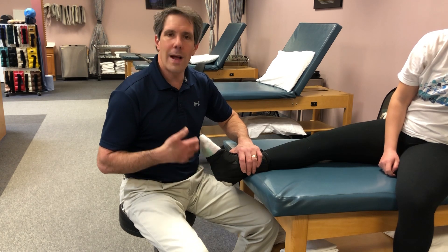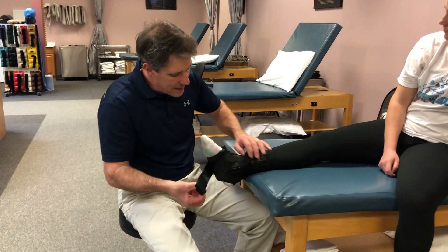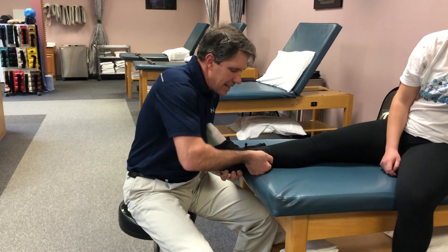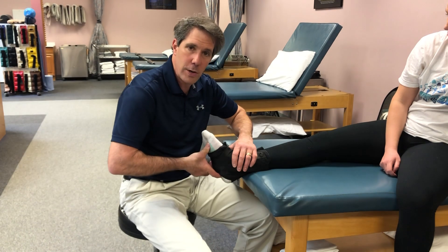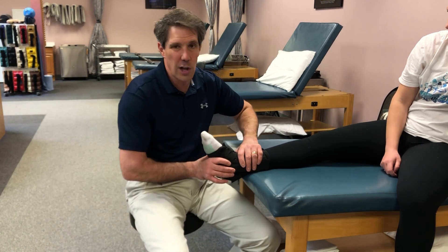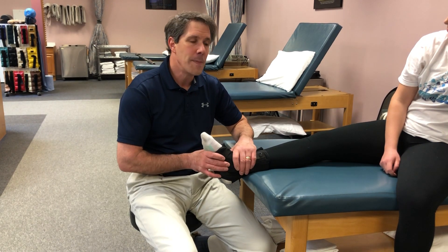The most important part about a lace-up brace with straps is that the last step is the inside strap: you pull it up and turn that inside part of the arch upward a little bit so it prevents the foot from collapsing down and out when bearing weight. It's a very good piece to help, especially early on. But you want to get out of your brace as soon as possible and start to restrengthen your foot — just not so soon that it causes irritation or inflammation.